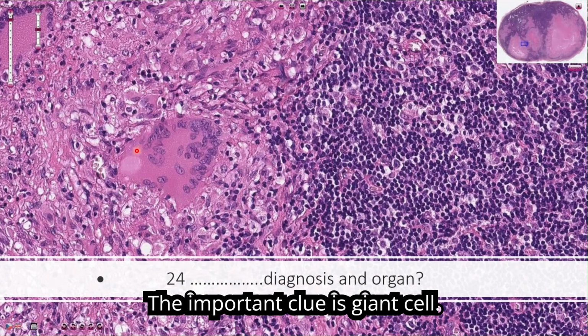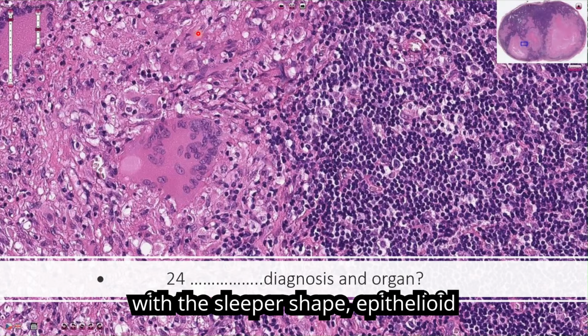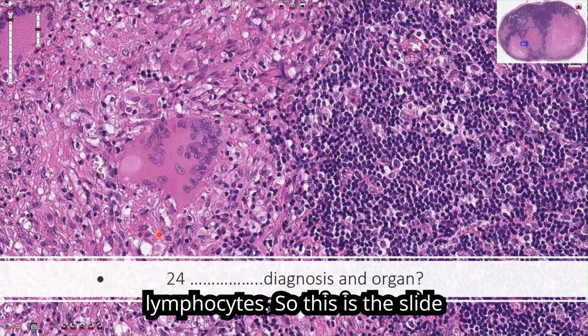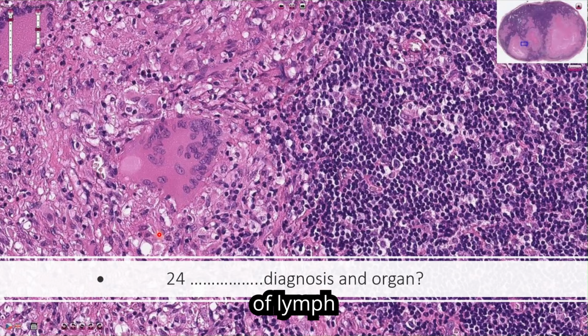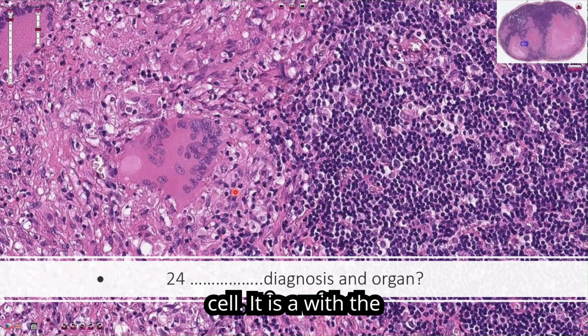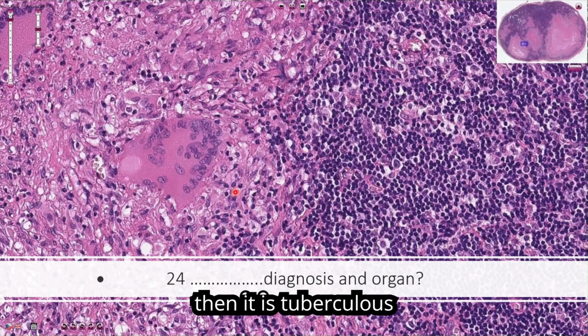The important clue is giant cell. So this is a Langhans type of giant cell with slipper shaped epithelioid cells, fibroblasts, lymphocytes. This is the slide of a lymph node having granuloma. Because of the appearance of Langhans giant cell, if caseous necrosis is present, then it is tuberculous inflammation.